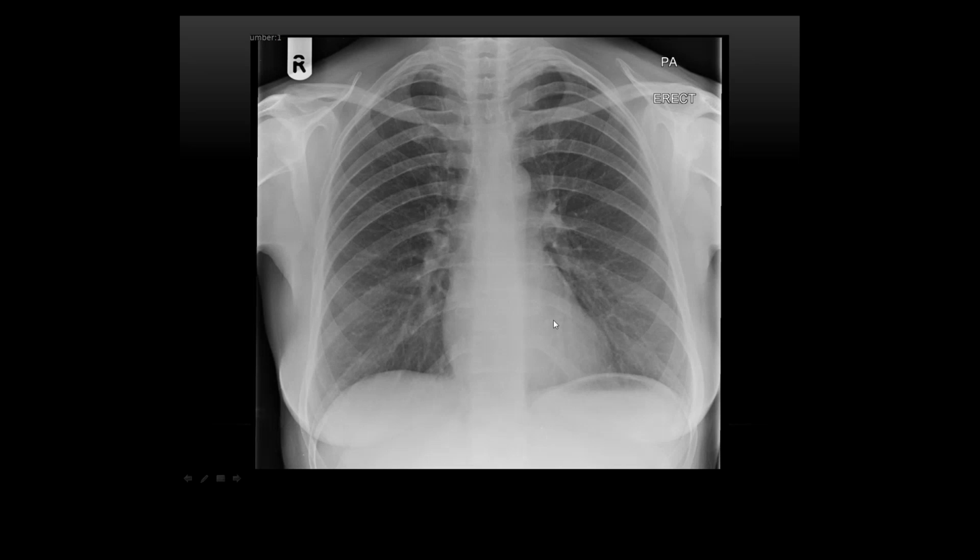Next, like I said, my system of systematic review of chest X-ray, I call it the inside-out method. Instead of doing ABCs, I work in the centre and I work out towards the peripheries of the chest X-ray. When I started off chest X-ray reporting, I actually started on the outside of the chest and worked my way in. The reason for that is because I was an MSK reporter initially, so I was more comfortable looking at the shoulder girdles, the clavicles, and then working into the chest.